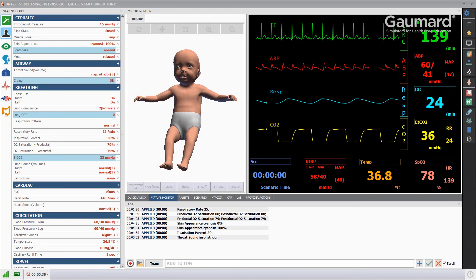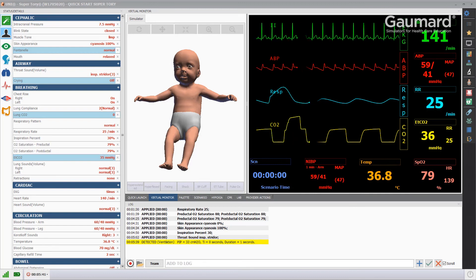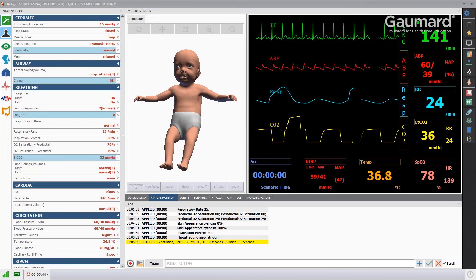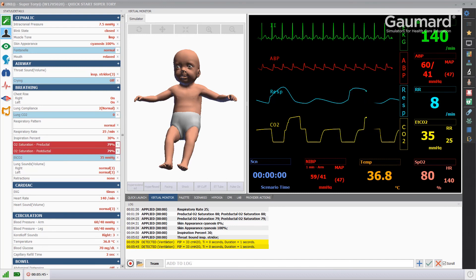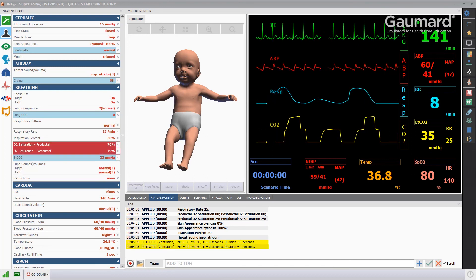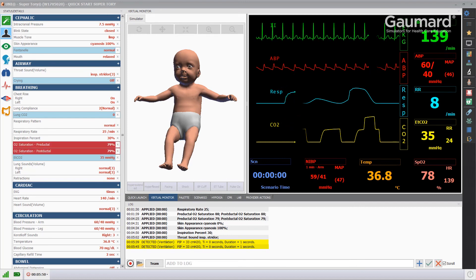SuperTori has automatic programming that changes complete breaths to small inspiratory gasps once two or more assisted ventilations are detected, allowing providers to manage ventilatory support via BVM or mechanical ventilation.